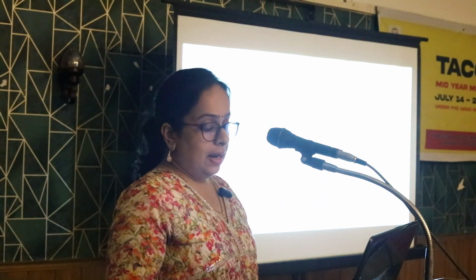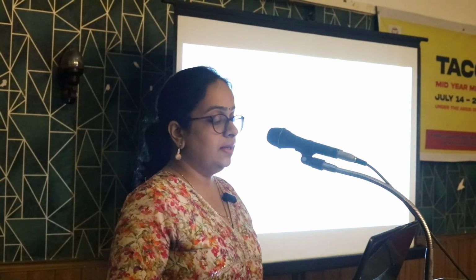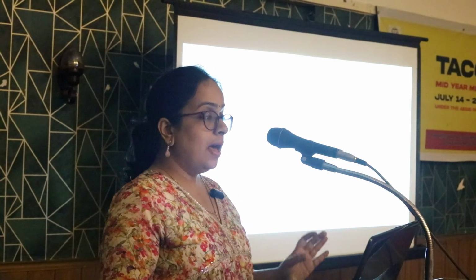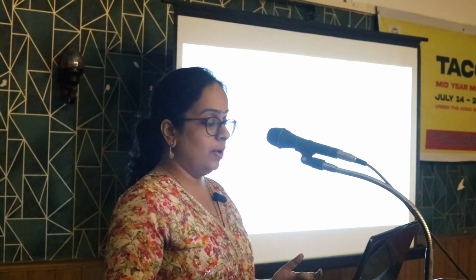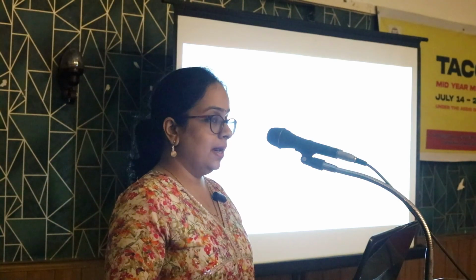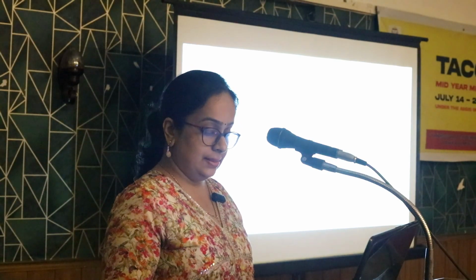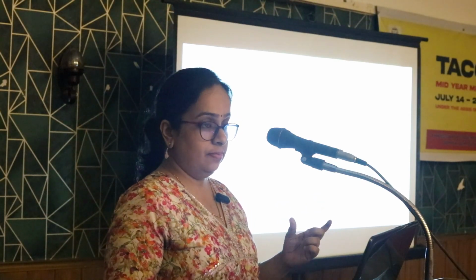The functional analysis is mainly done by the visual field. 30-2 analyzes 76 points within 30 degrees, and in glaucoma we mainly analyze the 24-2, which contains 54 points within 24 degrees, in which all the edge points of 30-2 are removed and only the nasal part is kept, because a nasal step is the first field defect which may appear.